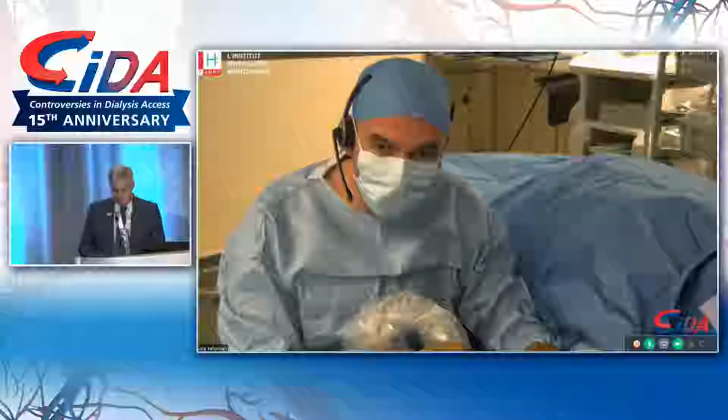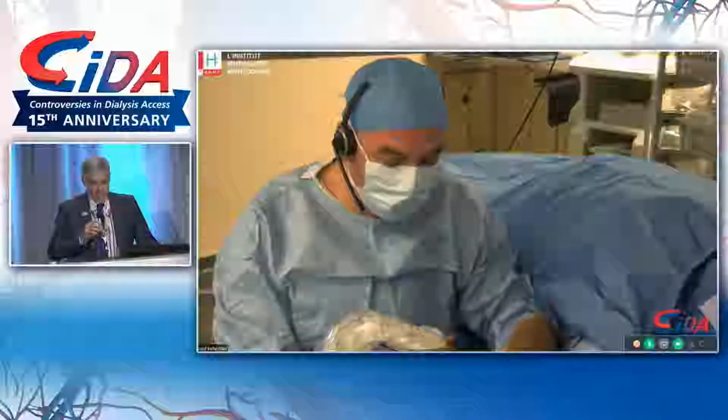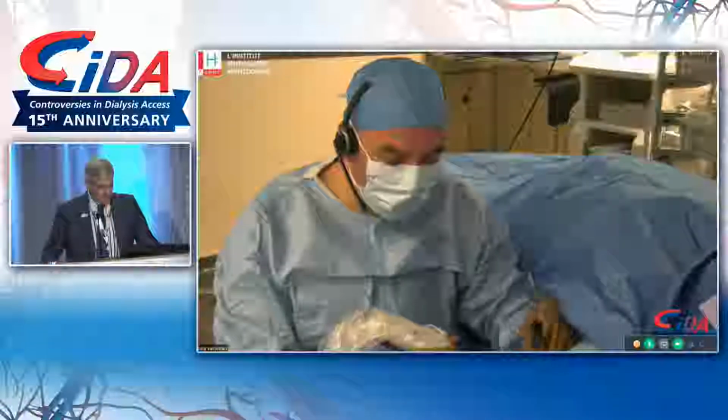Okay, we ask everybody to have a seat. We're going to go live to Paris. We're going to be doing a couple of endo AVF cases, the two different devices. You get to see them here at CiDA. And the first one will be Dr. Mallios from Paris.